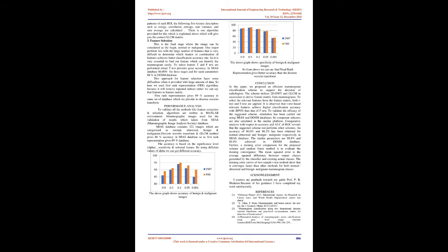B. Multi-resolution analysis using 2D DWT. In the multi-resolution technique, the underlying texture of mammographic ROIs is analyzed by a zooming in and out process. The discrete wavelet transform decomposes the mammographic ROI into a number of sub-images at different resolution levels, preserving the high and low frequency information.